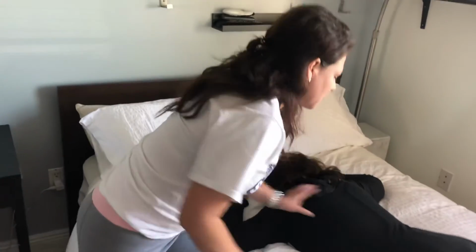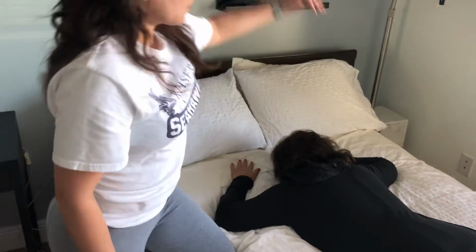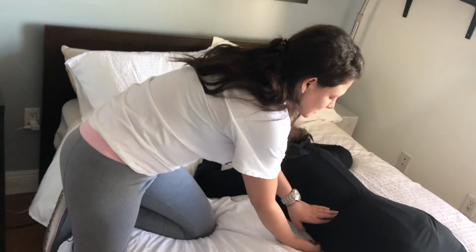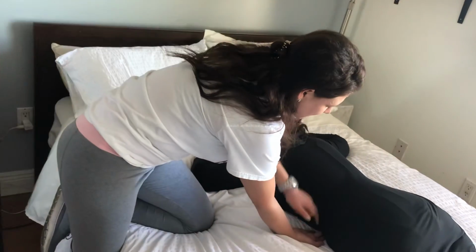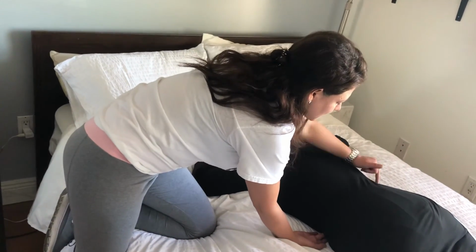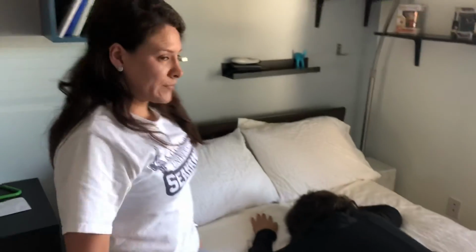If we're gonna do this one for the rectosigmoid, we're gonna angle caudad, 30 to 40 degrees caudad. The center ray is gonna exit just at the level of the ASIS. So here is her ASIS. It's the same 11 by 14 cassette, and the center ray is gonna be over here. All right. Thank you so much.